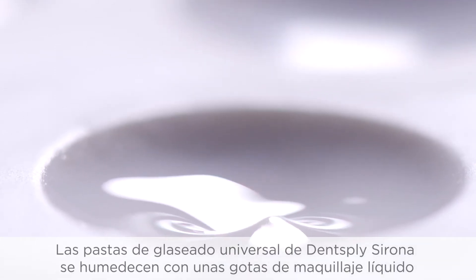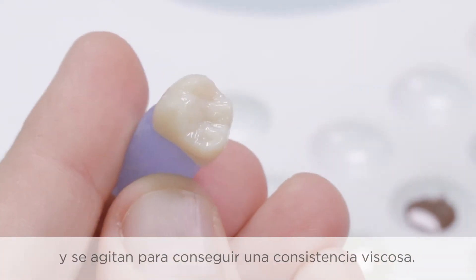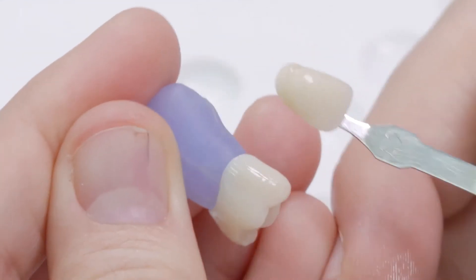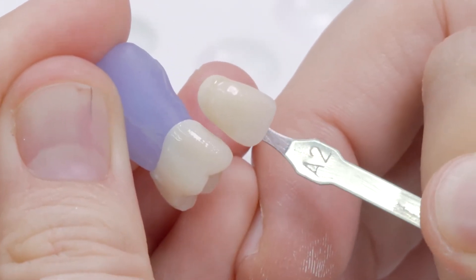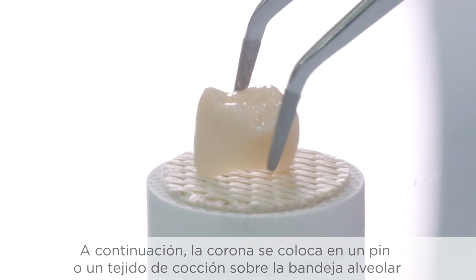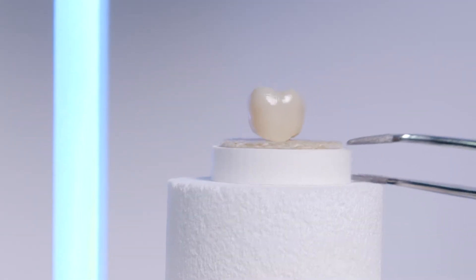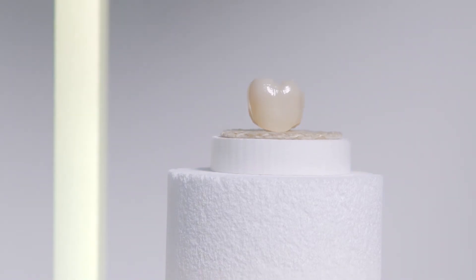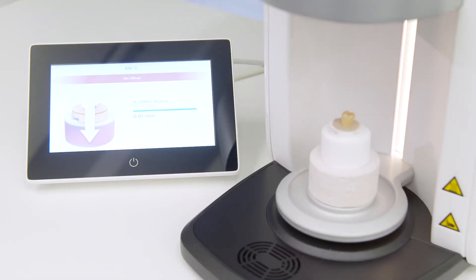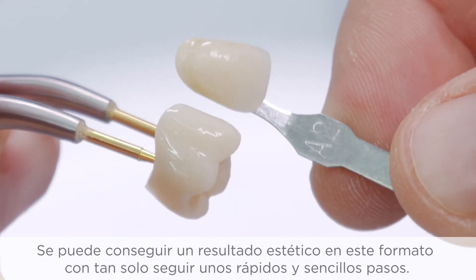The Dentsply Sirona Universal Glaze pastes are wetted with a few drops of stain liquid and brought to a viscous consistency by stirring. The glaze paste can be homogeneously applied on the crown surface. The crown is then placed either on an investment pin or the firing fleece on the honeycomb tray and fired in the preheated Seric Speedfire using the appropriate firing program. An aesthetic result can be achieved in this variant with quick and simple working steps.